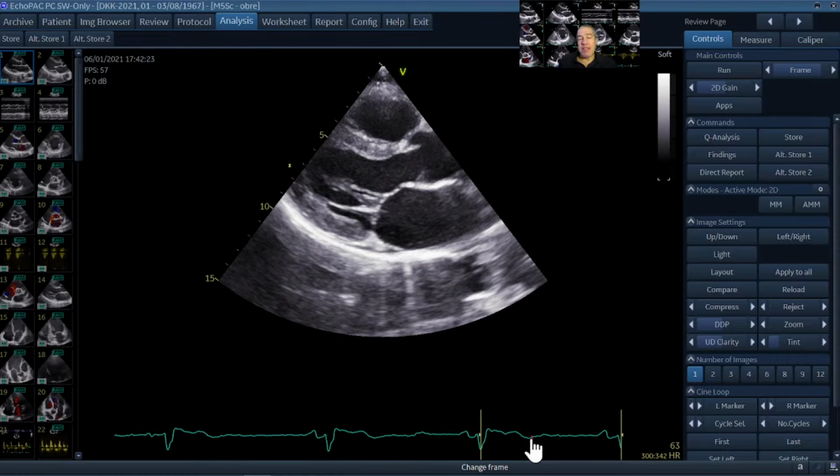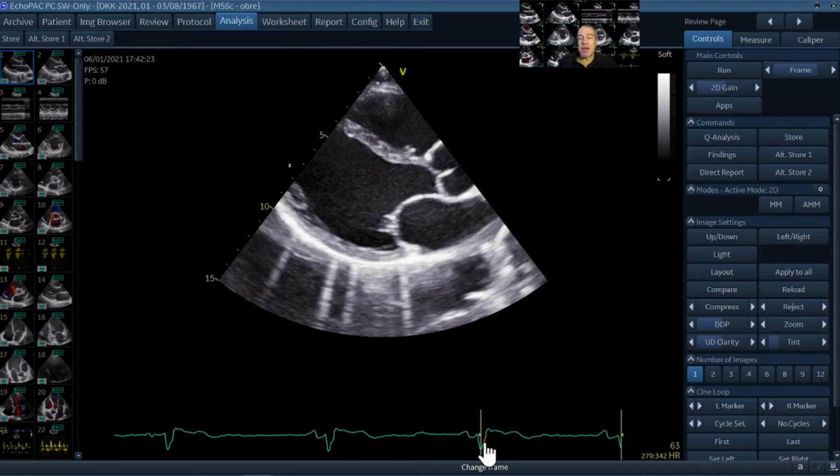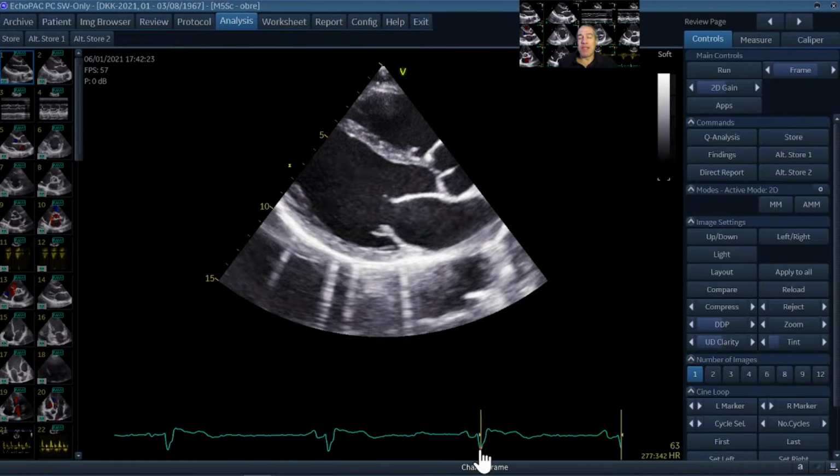And diastole, as you may know, can be well defined by the QRS complex. So at the time of the QRS complex, or sometimes depending on the width of the QRS complex at the beginning, at the onset of the QRS width, this is what we define typically as end diastole.